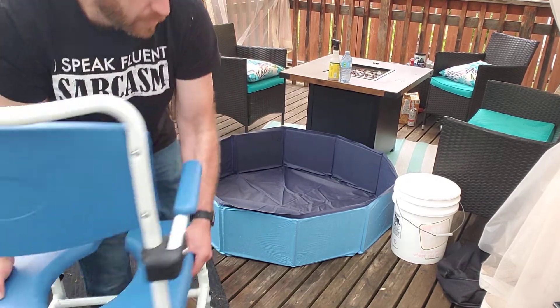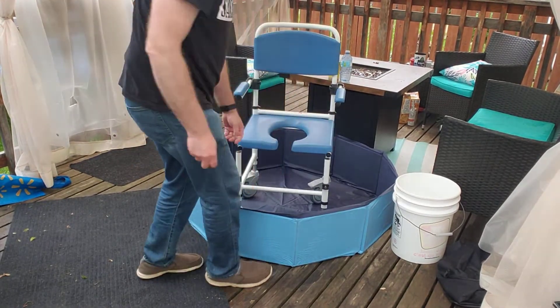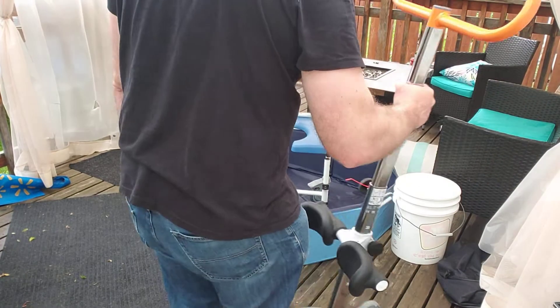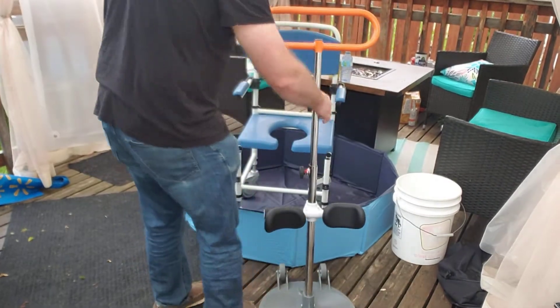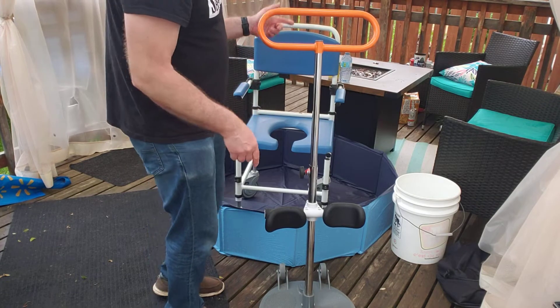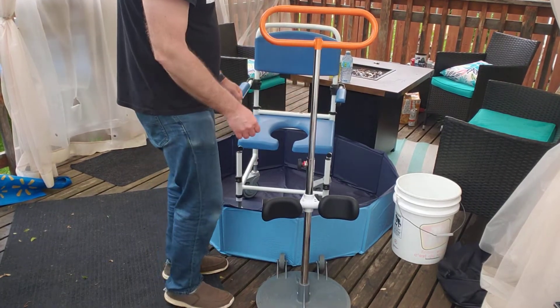What I use is a shower chair. My dad has limited mobility — he had a few strokes about six years ago. I use a sit-to-stand device to transfer him from his chair to this chair so we don't have to somehow get over the wall of the pool.